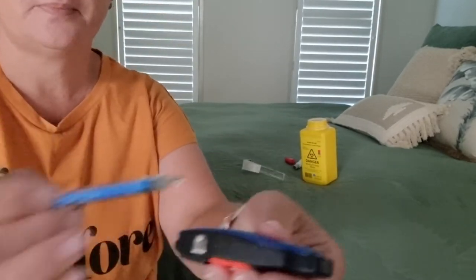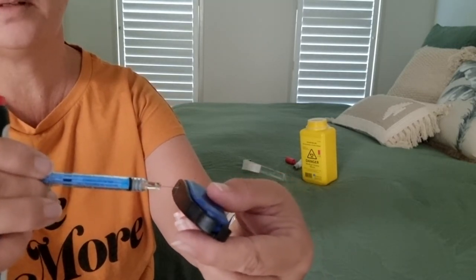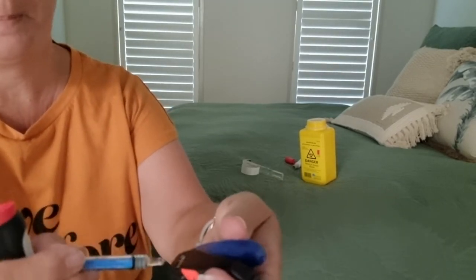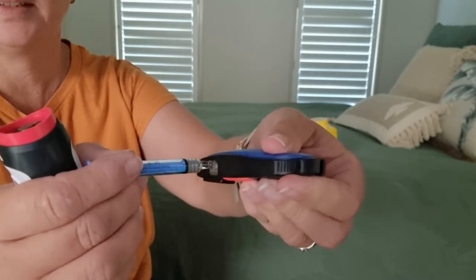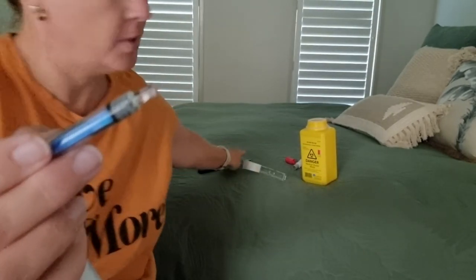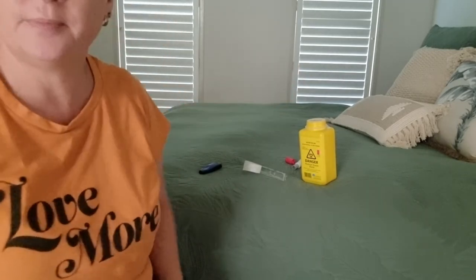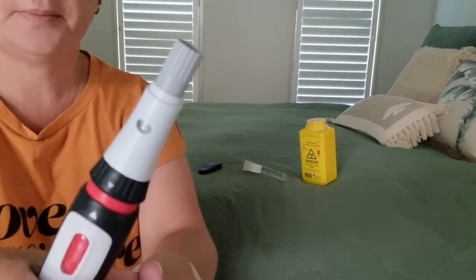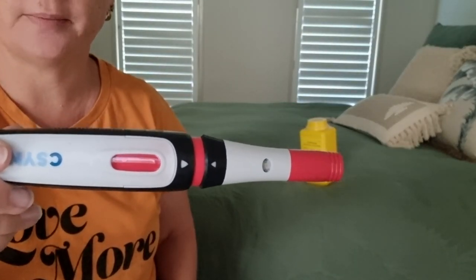We're going to use the needle cutter. Insert the needle into the hole — open it up. Click — it breaks the needle off. That way you can put the cap back on safely with no injury, and straight into the sharps container. Then this just screws back together, good to go. Put the cap back on and it's ready for your pack. That's all it is — easy as one, two, three. You can do it.